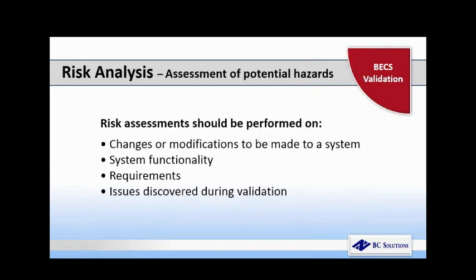So the sort of things that you would need to perform a risk assessment on, there are different items that you would need to assess for potential hazards. One of the first things would be changes or modifications made to an existing system. If you have an existing system and you're doing an upgrade and you need to determine whether or not you want to do a validation or how much validation you need to do, you would go in and perform a risk assessment on the changes or modifications.